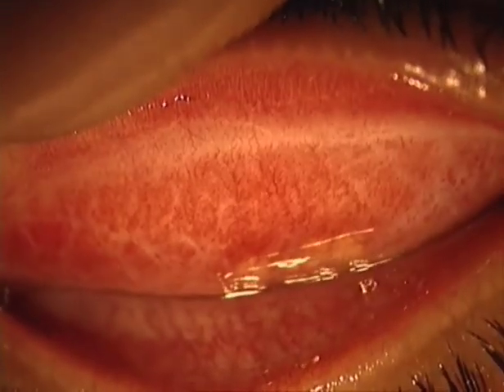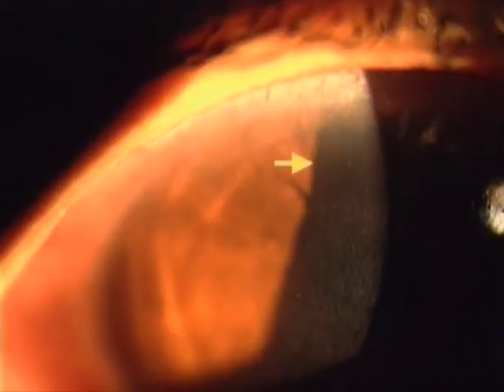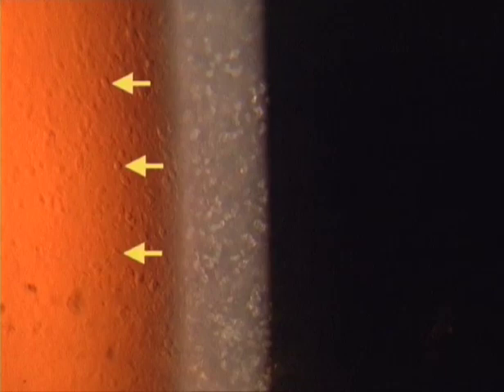More severe changes occur in this case of cicatricial conjunctivitis, with intense stippling of the cornea, which is confined to the interpalpebral area, while the areas covered by the lids are free. When observed with the contact glass without a red filter, we see the stipples appearing like white scales in scattered light, whereas in indirect illumination against red fundus light, they are transparent and produce refraction phenomena indicating surface elevations.